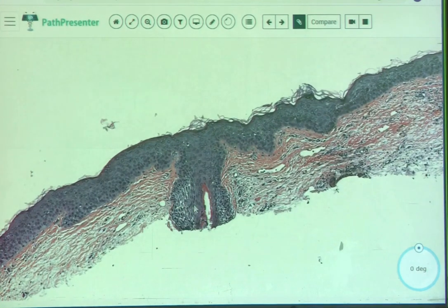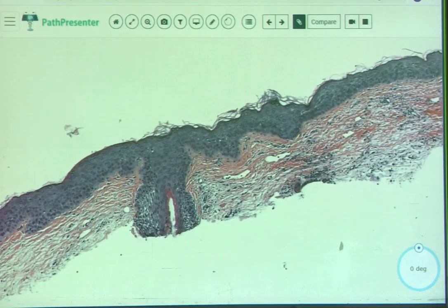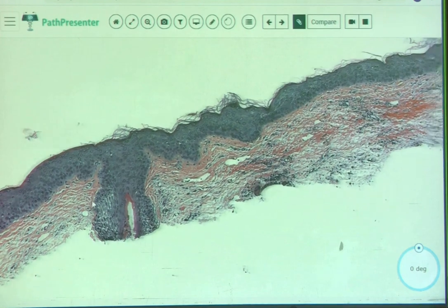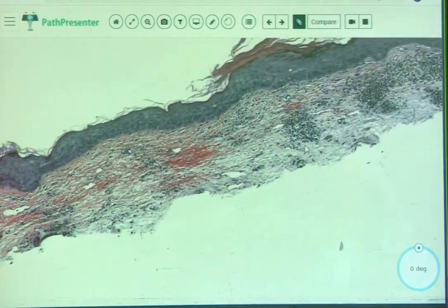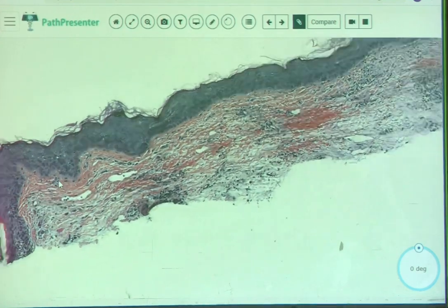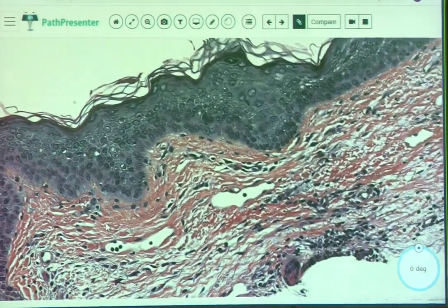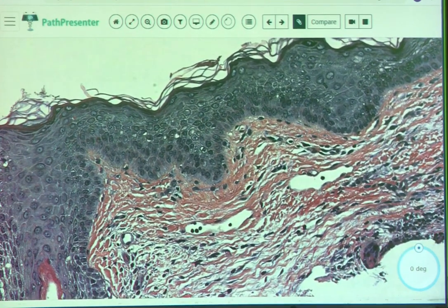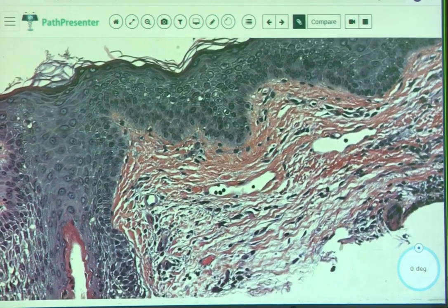See it now? Yeah, the hair follicle. That is a hair follicle, yes. So it's involving that. No, not really. But what about all this stuff beside it? All this stuff here. That looks, yeah, that's better. More atypical. That looks kind of funny, right? Yeah. Less organized, bigger. I did tell you, you picked a hard one to start with.